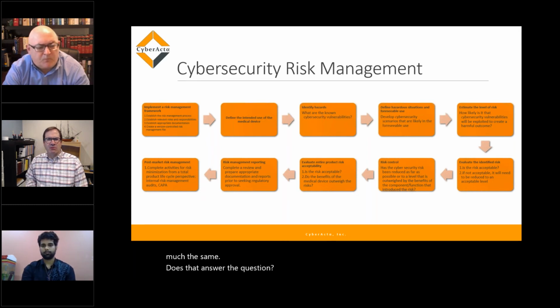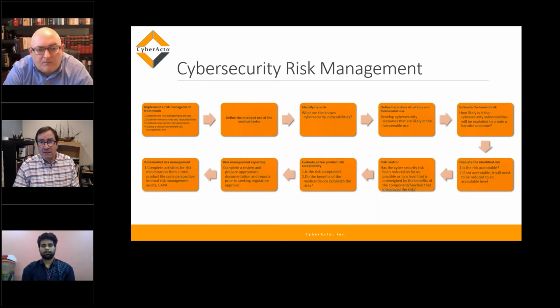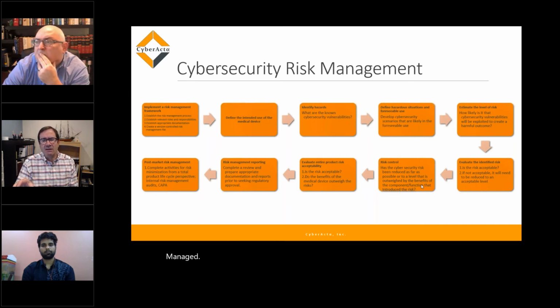What I'll add to that, presumably, and I'm less familiar with AI or machine learning, although I understand the concept, is that you can anticipate ahead a little bit, having designed the system, the breadth that the machine learning or the AI could take. So you want to anticipate those things with the risk management. But as John mentioned, you may not know entirely where that machine learning is going to go in the long term. So you want to continually cycle back and update your risk management, your predictions of where this AI can go over time, and try to stay a step ahead of it.